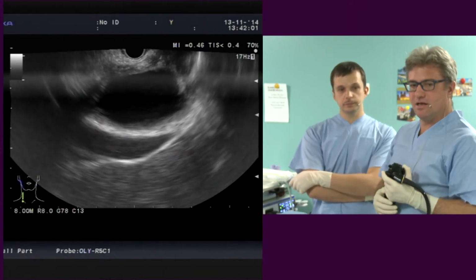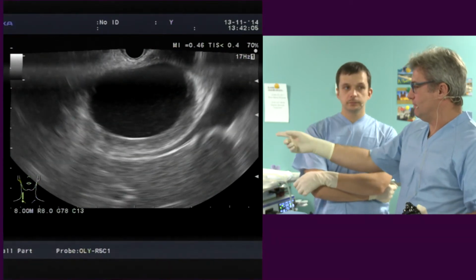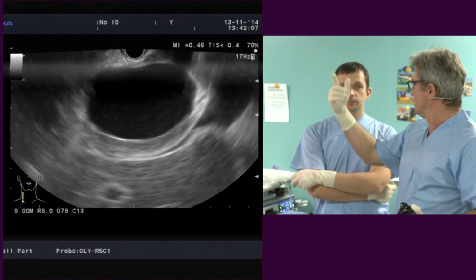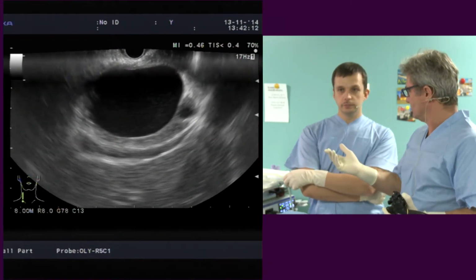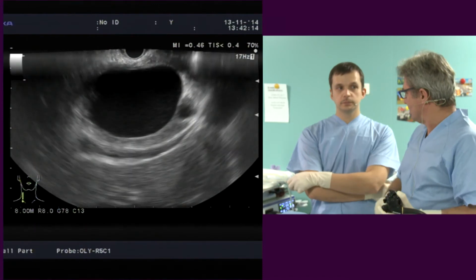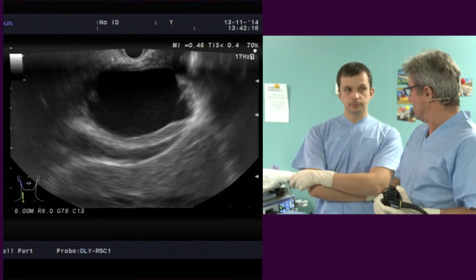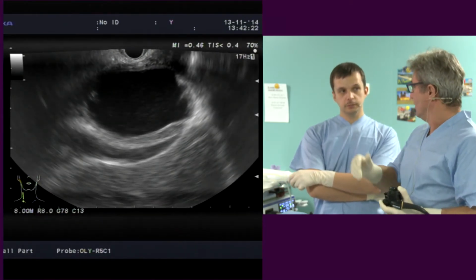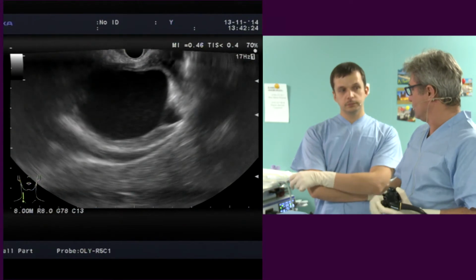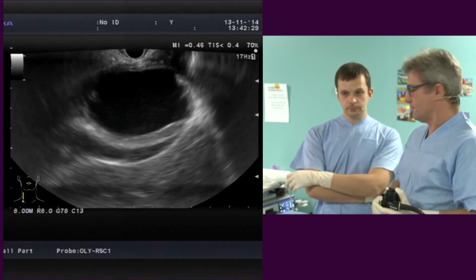So I think if you place the stent between the collection and the stomach, it does not cause complications, because it can stay there forever and there are no problems. While if you place a plastic stent in the pancreatic duct, you can have strictures, you can have inflammatory reaction, and you can have problems that you don't have by placing it transmurally.